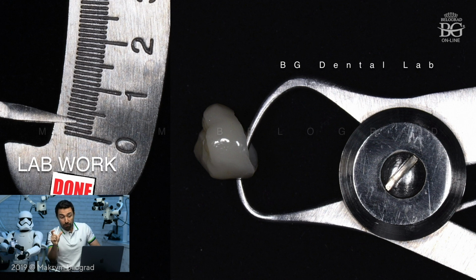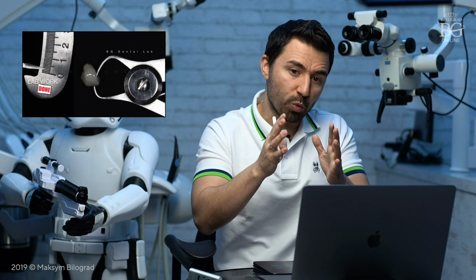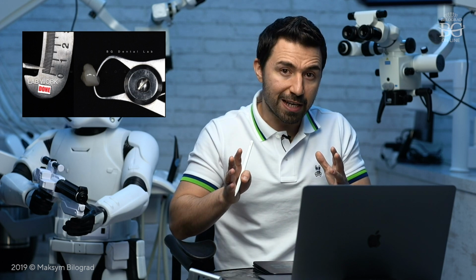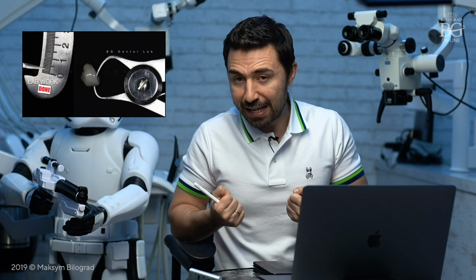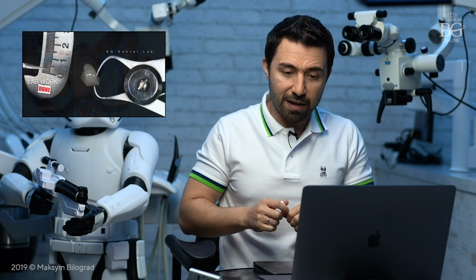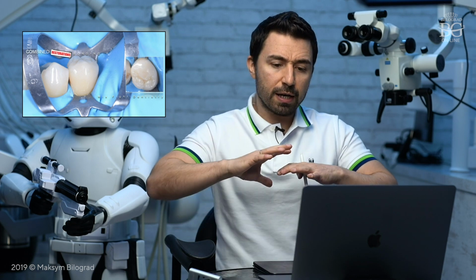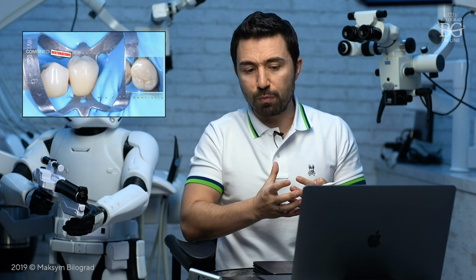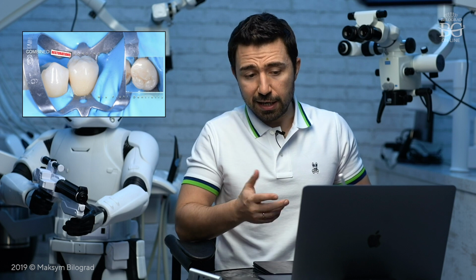The thickness of the crown that is written in the instructions includes dental mistakes that we sometimes make, like adhesive mistakes, preparation mistakes, thick spacer, etc. So if the material is 1 millimeter, the material is strong itself, it will survive and resist some procedural mistakes through the thickness. That is the issue of thickness of materials. But if you respect the preparation, it is smooth, the fit is good, the enamel is preserved, it may work even with that thickness that you saw in the previous slide.